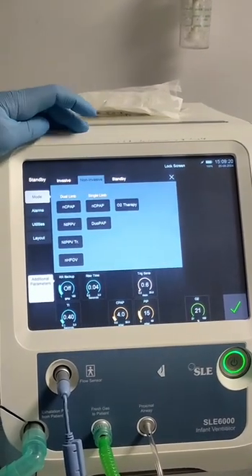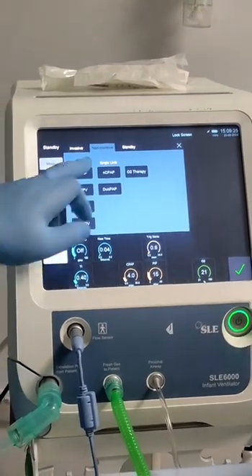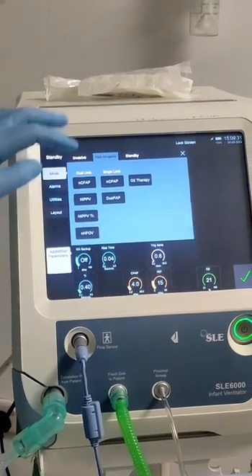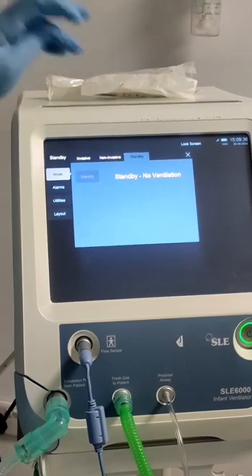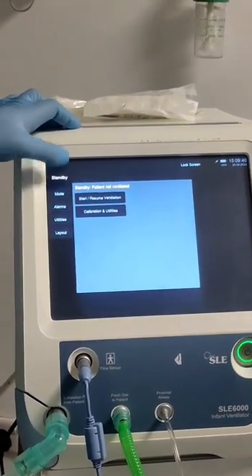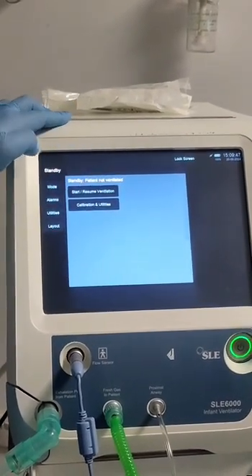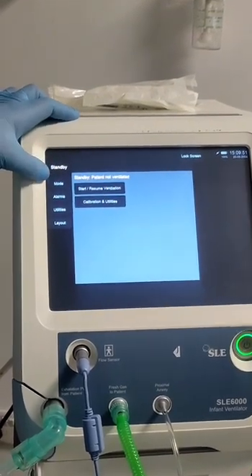For non-invasive, we also have two options: dual limb — same as what we have here — and also single limb with inspiration only. We also have O2 therapy here. For standby, we can press here and it will go to standby. We can also press for calibration, or for start ventilation, or the machine will go directly to ventilation.